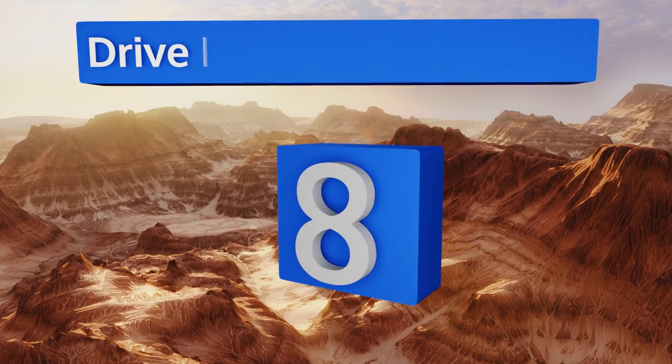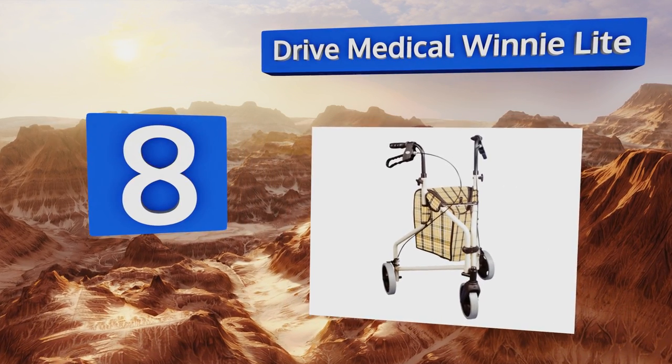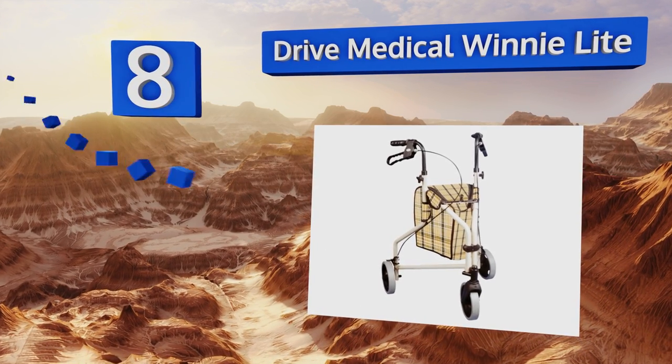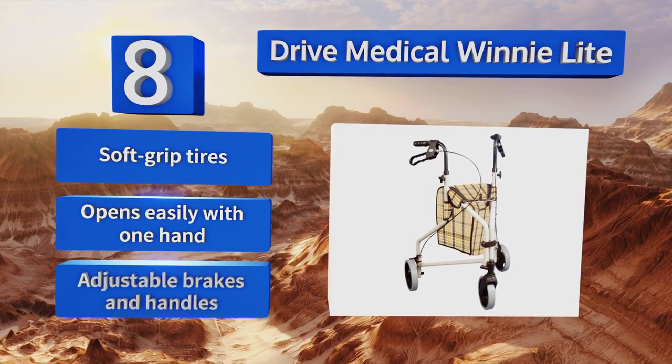Coming in at number eight, the Drive Medical Winnie Light is a smart choice if you're beginning to have trouble supporting yourself with a standard stick, yet you don't want to deal with the bulk of traditional rollators. It weighs just 11 pounds and folds flat when not in use. It's equipped with soft grip tires and adjustable brakes and handles, and it opens easily with one hand.